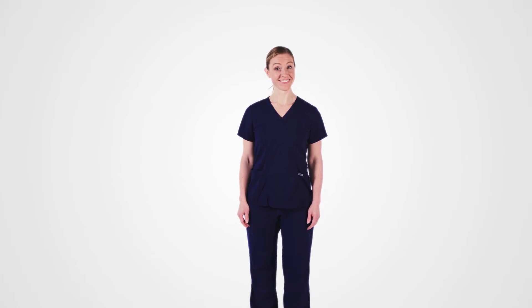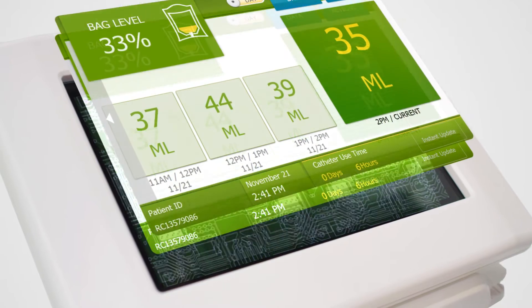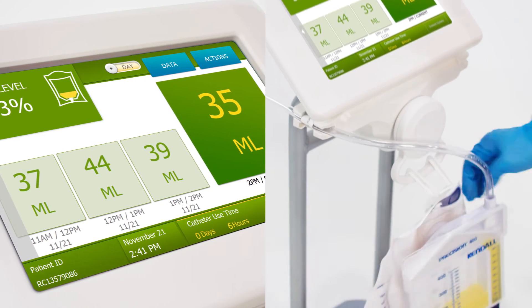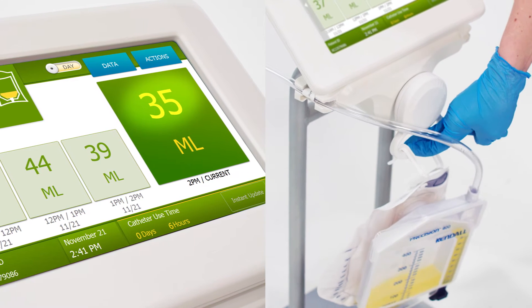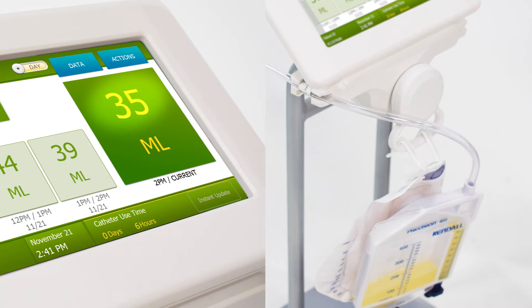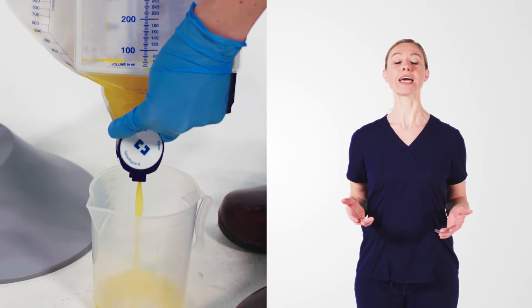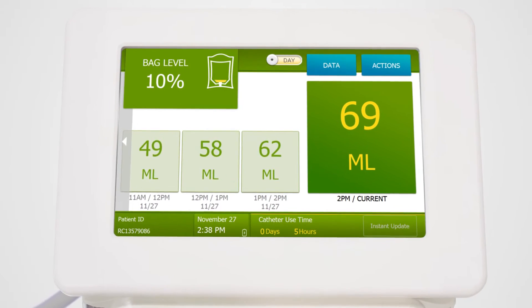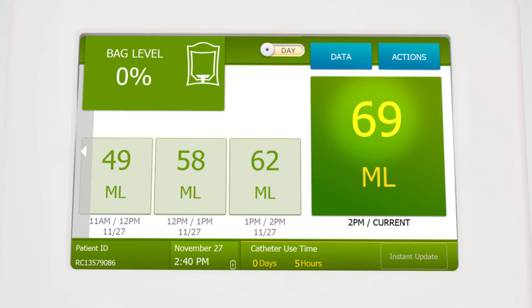Now let's talk about accuracy. There's built-in technology that eliminates potential artifact. For instance, I can swing the bag and you'll notice that the number doesn't go up. Or I can push down on the ring where the bag is hanging and nothing will happen. After a bag is drained, the system will recognize a decrease in weight and it will reset to zero. However, it won't change the volume that's already been recorded.